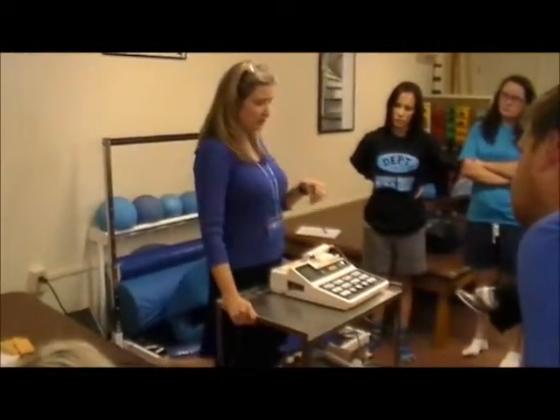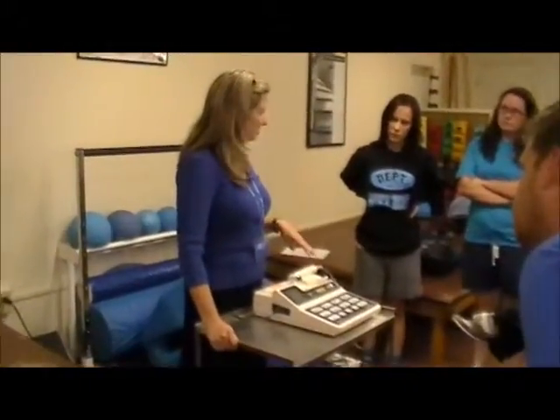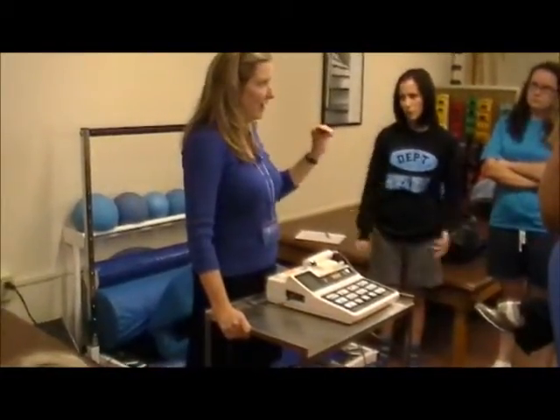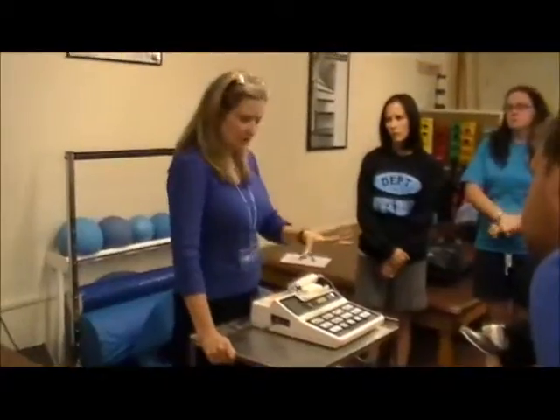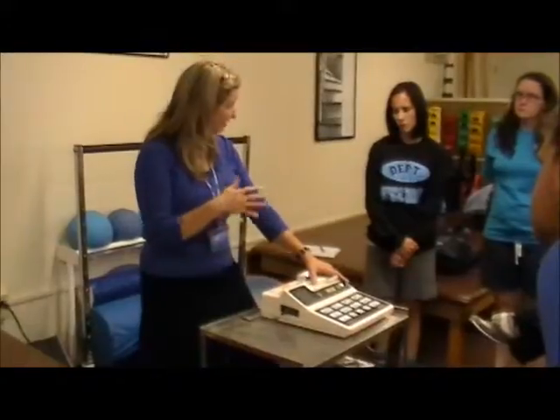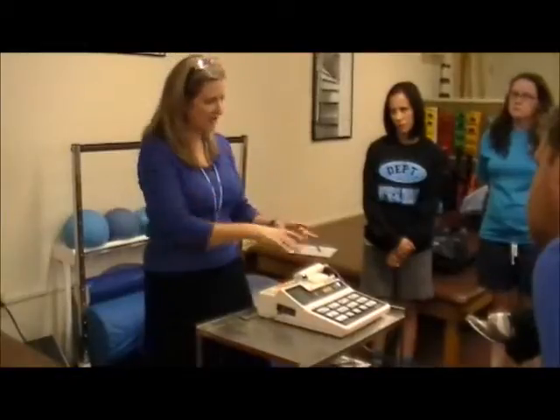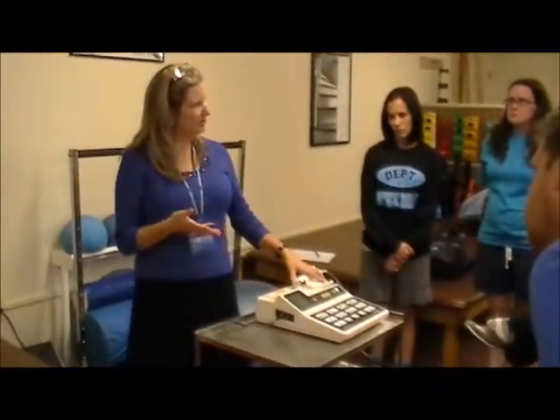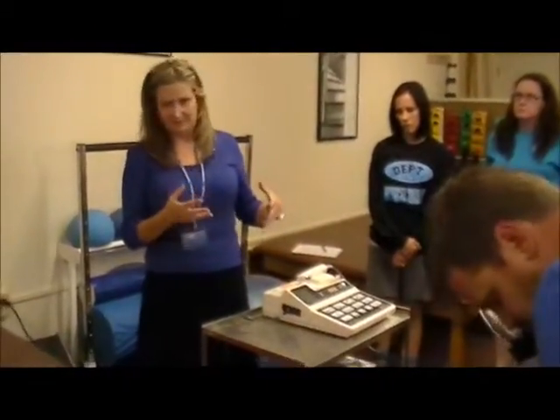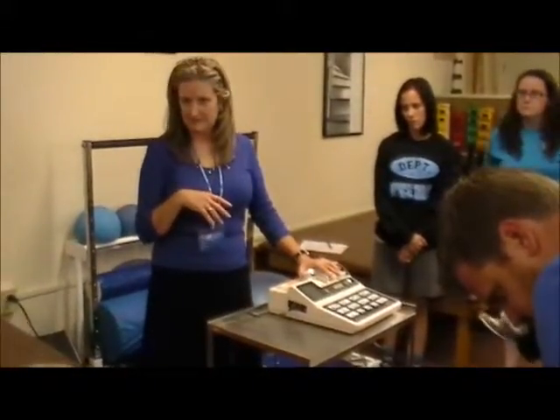Okay? Then when it's your turn to receive it, I want you to feel what it feels like. So that's the third goal, is that you feel what it feels like. So even if you've thought through, I want pinpoint, high rate, because, do that for what you're treating. Let the person feel that, but then while they're hooked up, let them feel what a scan would feel like, let them feel what a sweep would feel like, let them feel what high would feel like if you were doing low. Just modify it a little bit while they're still hooked up so they get the feel for that. So we're talking, again, only 5 or 10 minutes per person that you're treating as you're going through those. We're doing some thought processing first.